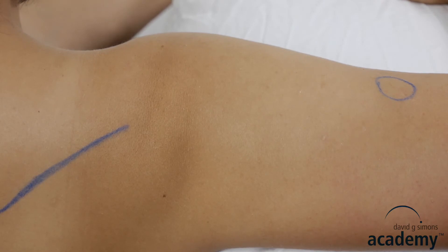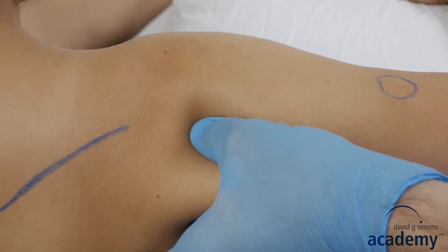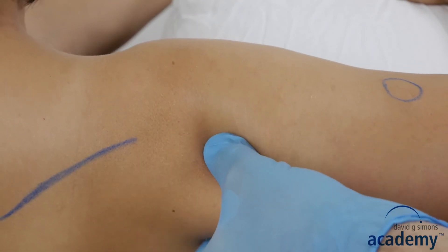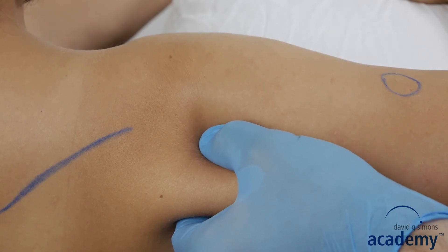Dry needling is done here with a pincer grip. As always, keep the tip of the needle properly in the safe area of the pincer grip. Now disinfect.